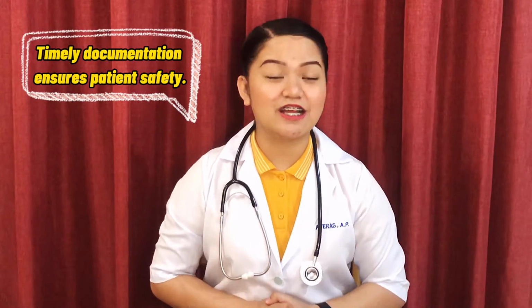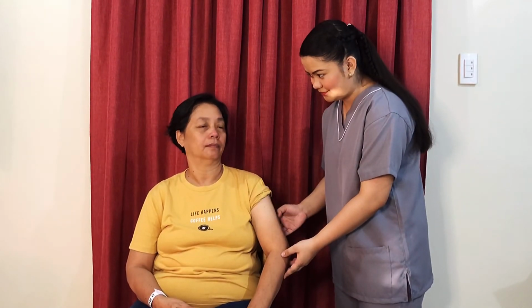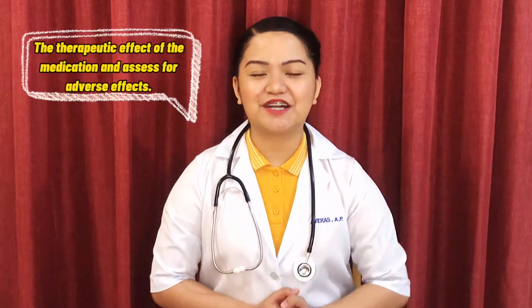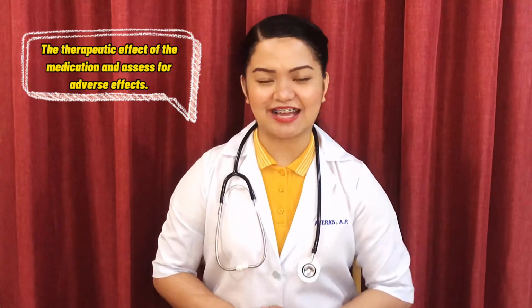And next, document the procedure and findings according to agency policy. Timely documentation ensures patient safety. And also, evaluate your patient's response to medication. It is important to evaluate the therapeutic effect of the medication and assess for adverse effects.